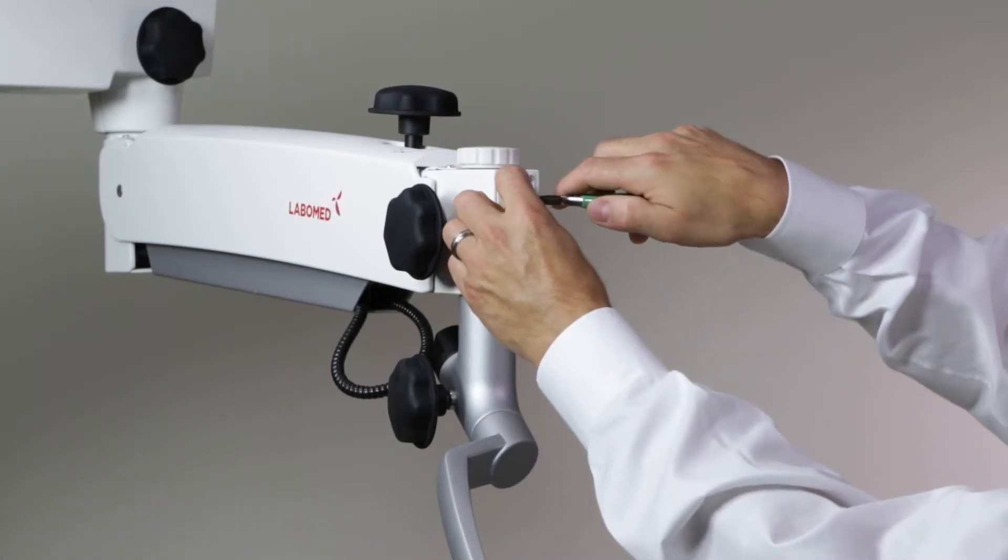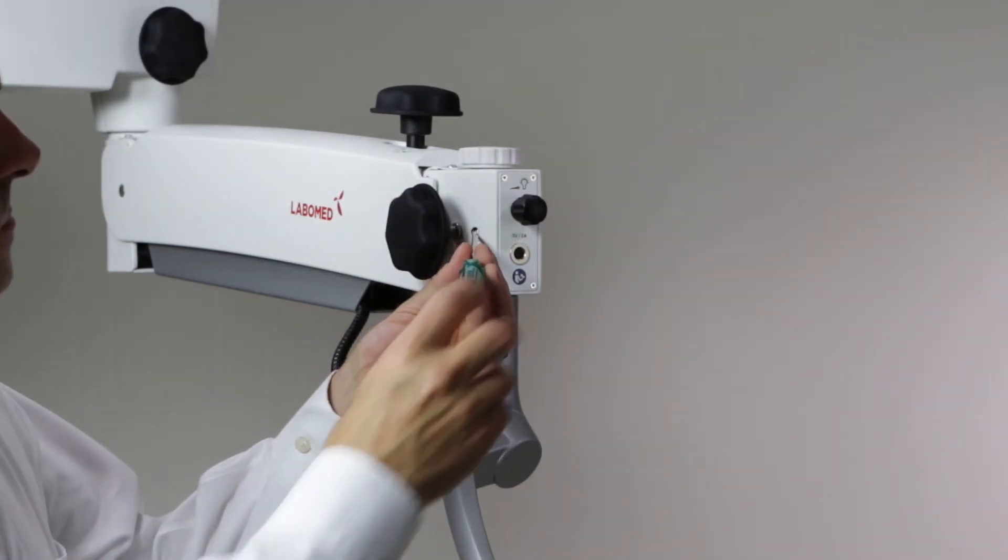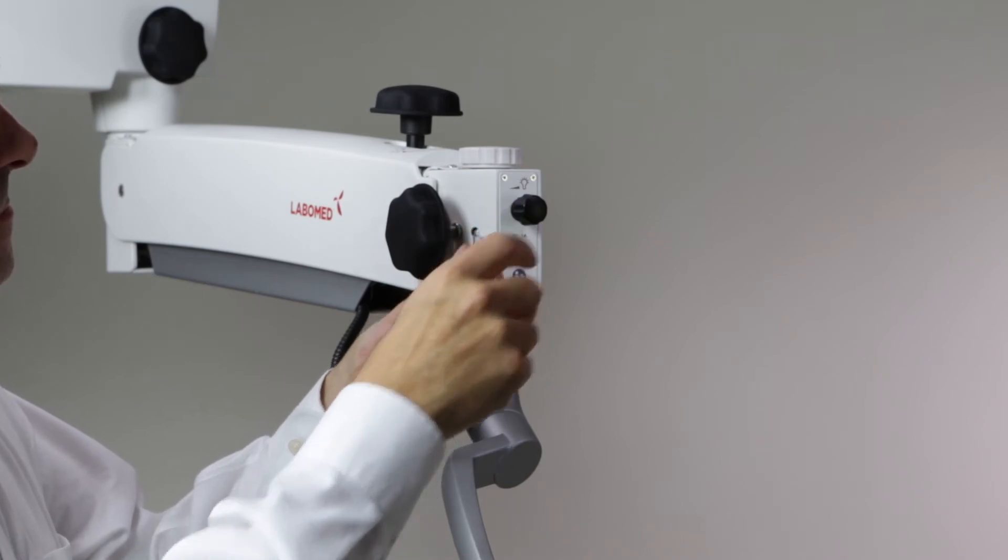Remove the safety screw from the bag attached to the illumination control knob and screw it into the hole next to the illumination knob.